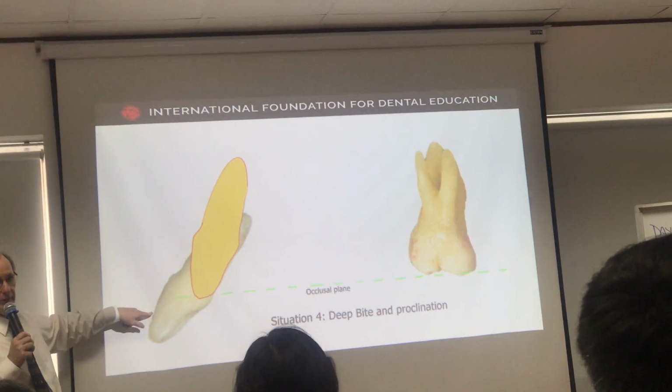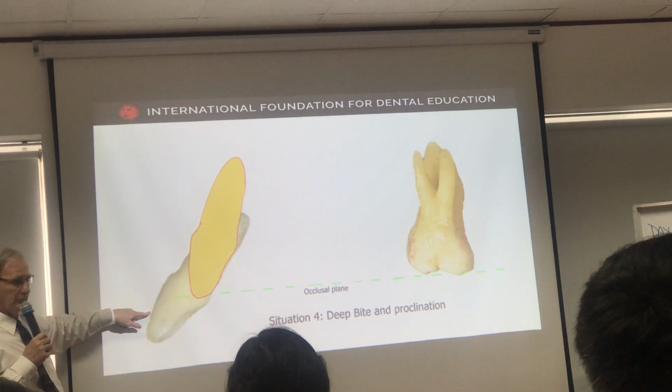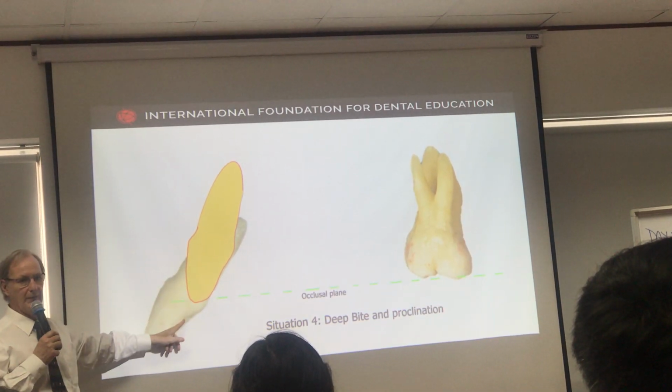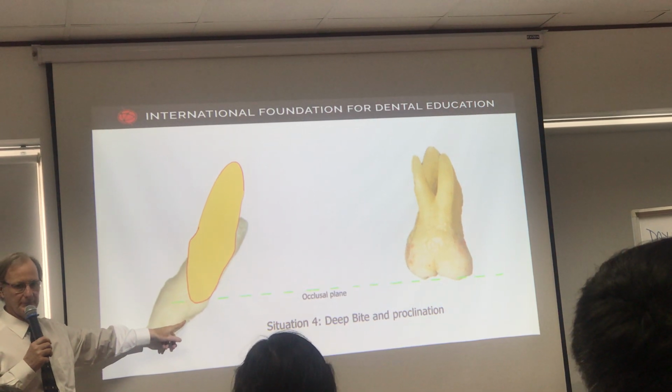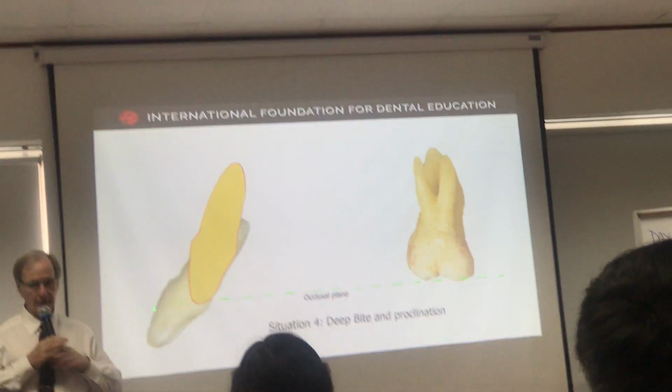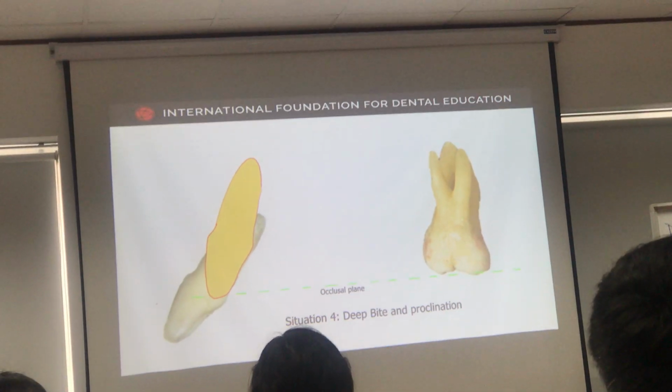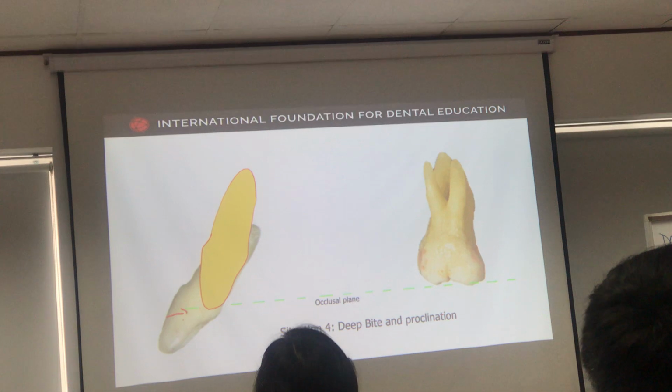If I put a straight wire here, can I achieve that with the straight wire? And I push, the tooth is going to do this, it's going to get almost the same inclination. If I put the bracket here, get it? So if I just use the straight wire and I pull, just do this and I push on it, you always calculate, right?